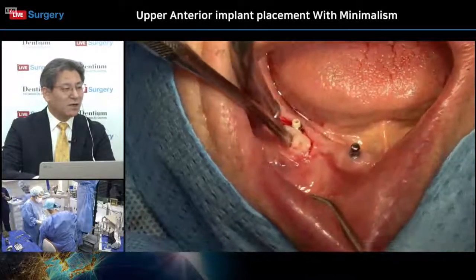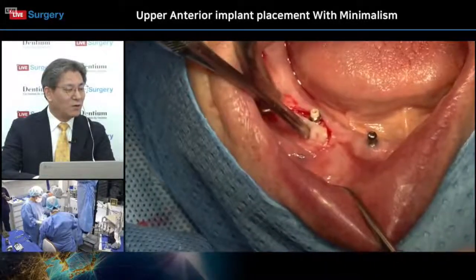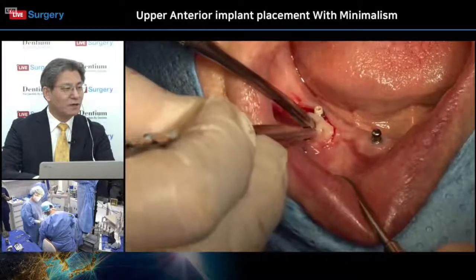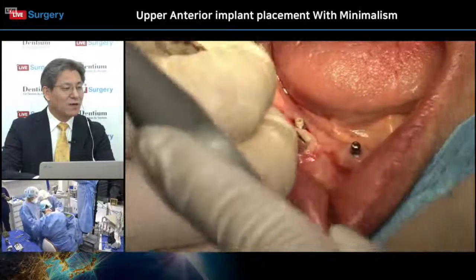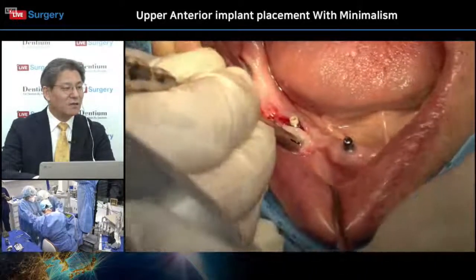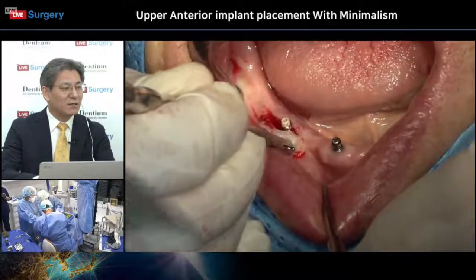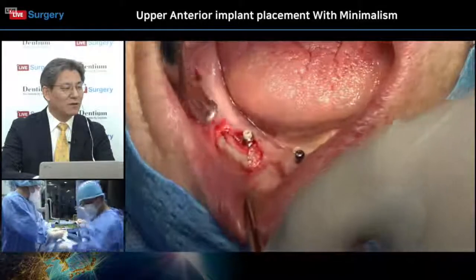So Dr. Chung is showing the pin technique instead of suturing. So this technique is also an authentic technique of Dr. Chung. He has his own technique for this bone pin fixation.